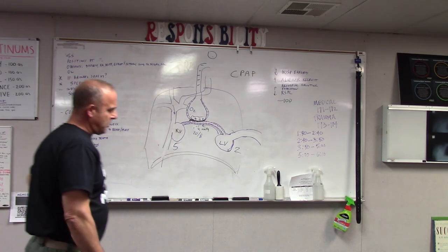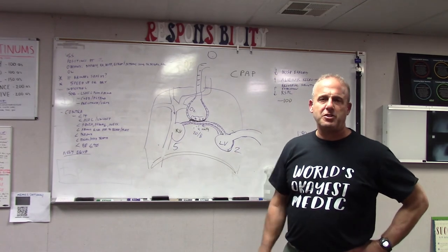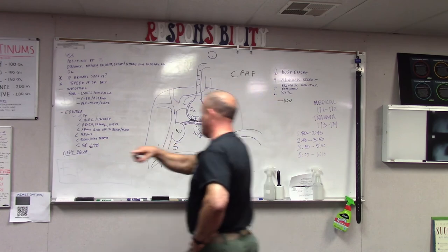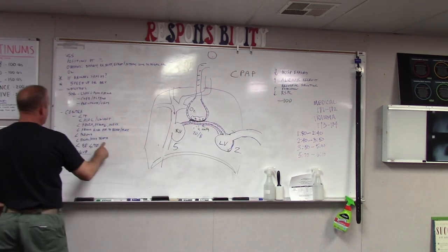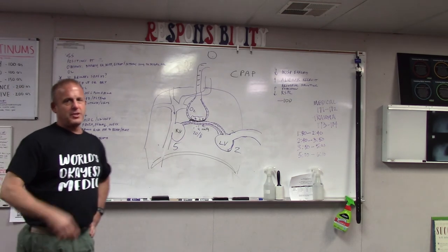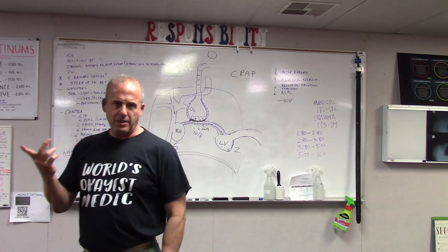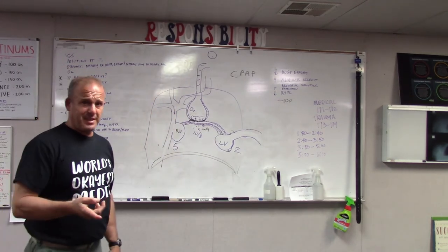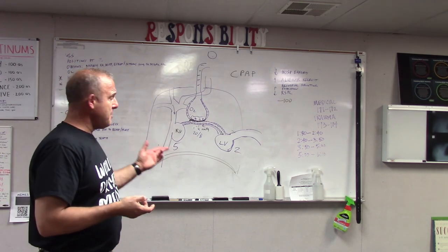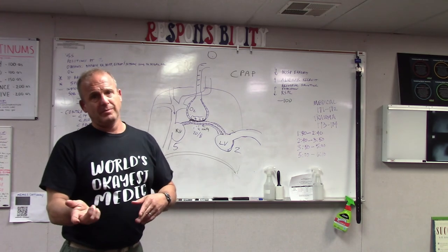And if they have facial or head trauma, well, that's not really clarified. If their face is too messed up or their head's too messed up to put the mask and straps on, that'll kind of nix it. And then on the blood pressure, lower than 90 is considered the magic number for the generic adult. That one older lady whose normal BP is 90 over 60, I'd give it and I'd tell them, hey, that's a normal BP. Best thing about CPAP, if you put it on and it doesn't work, take it off.